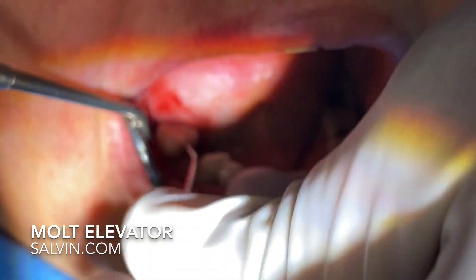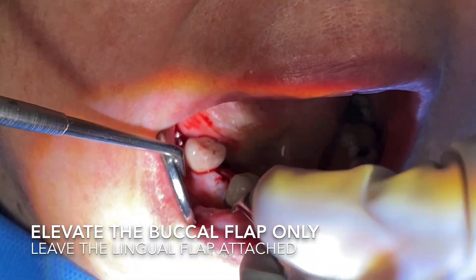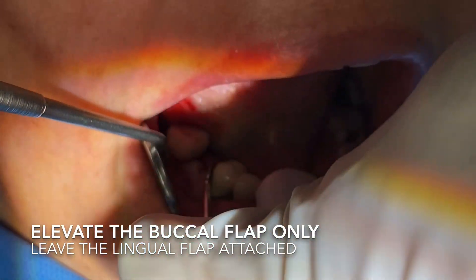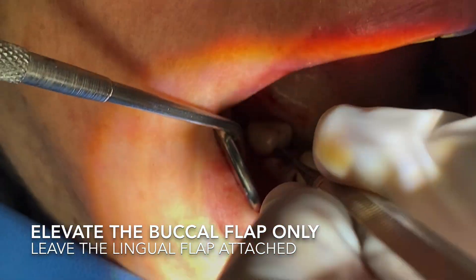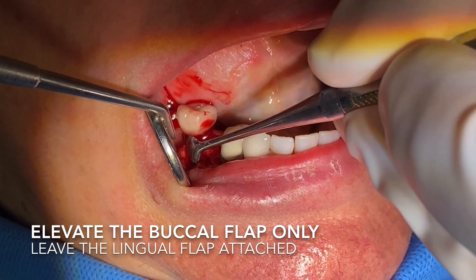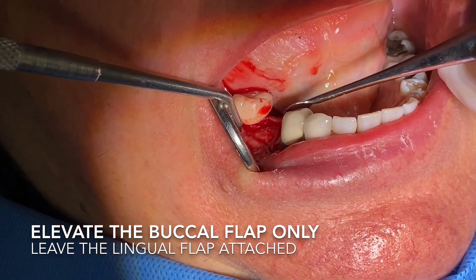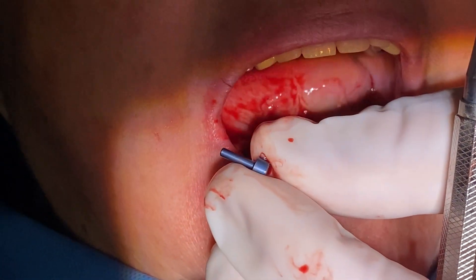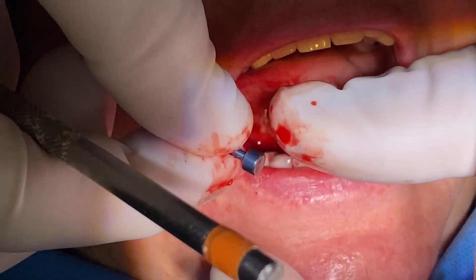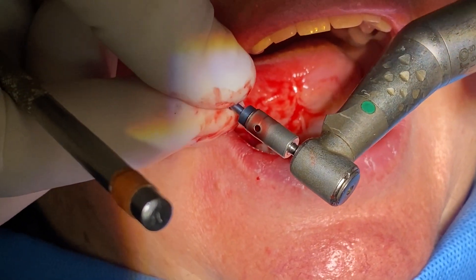I'll use a molt elevator — I bought this from Salvin. Many different places have them, but the molt is a very effective way for you to elevate this without tearing. It's a fantastic tool. As we lift this back, we'll lift it up and you can see the bone. I'm not going to lift the lingual — you don't touch the lingual. This is going to prepare the patient for better healing and also better adaptation of the tissue around your new implant.